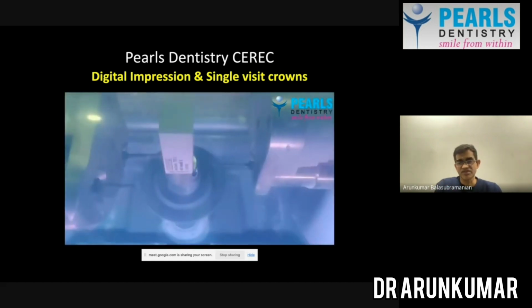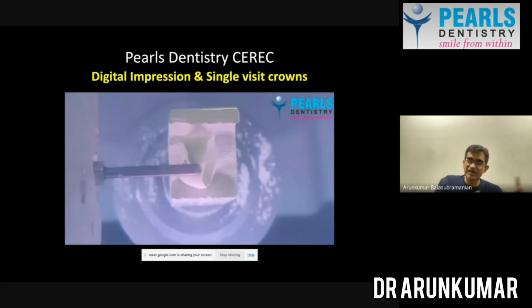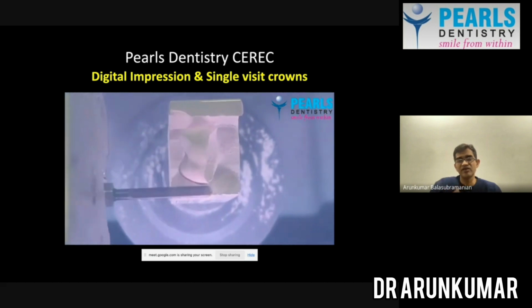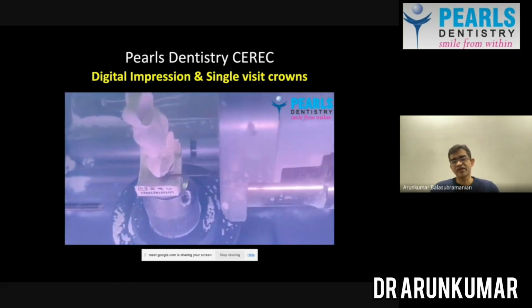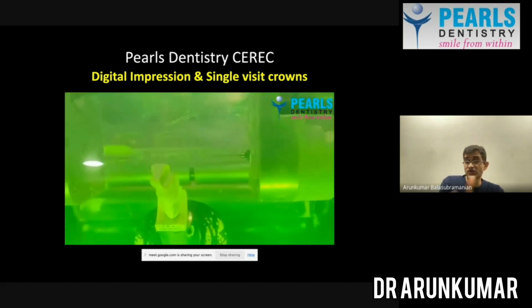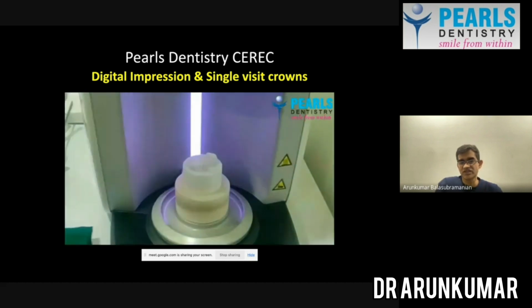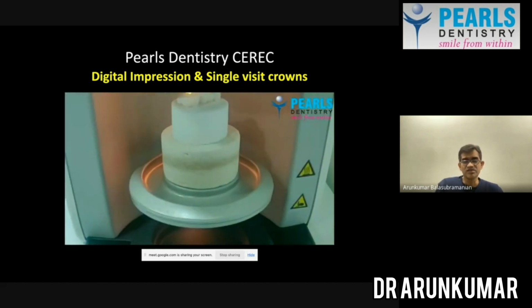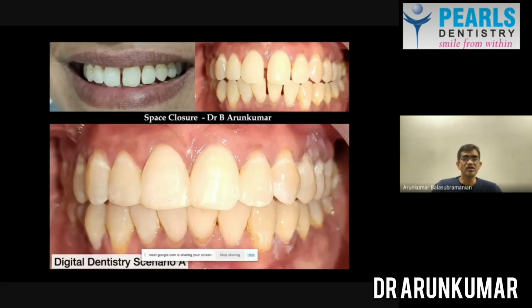We start the process and the crown is ready to be made now. So whatever design that we have done, the milling unit makes the crown now. Once a crown is made, now we need to strengthen the crown. That's the fourth step, the sintering process. Once it goes through the sintering process, it comes out, and then the crown is ready to be fixed into the patient's mouth. So this is what happens.